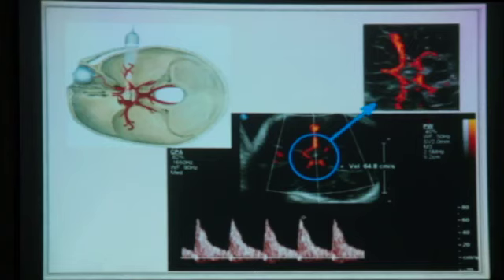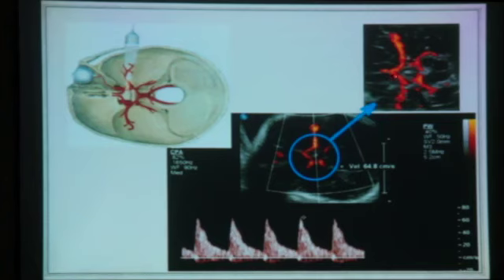If we magnify the image, the middle cerebral artery appears red because flow is coming toward the probe, while the anterior cerebral artery appears blue because it is moving away from the probe. The two anterior cerebral arteries and two posterior cerebral arteries are also visible in this color Doppler view.